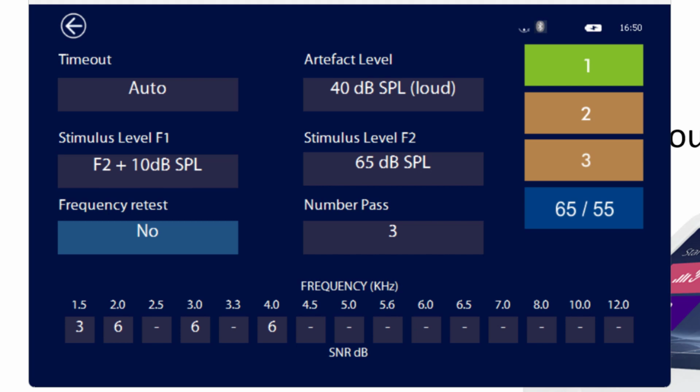I have been using Protocol 1 and Protocol 2 in this demo. Protocol 2 is, oh, I actually changed the stimulus level here by accident, I see, but no, I didn't. It was at 55, right? I'm confusing myself. Sorry for that. This was more a setup for showing that we can measure high frequencies. Yeah, showing how it can be used differently.